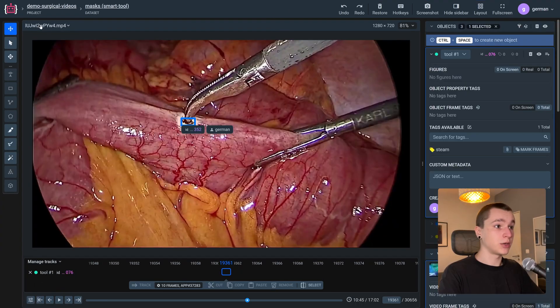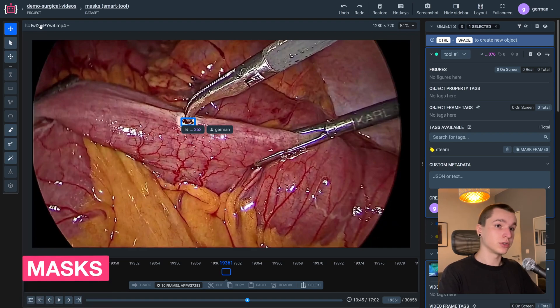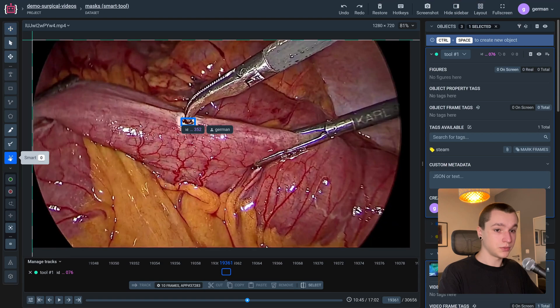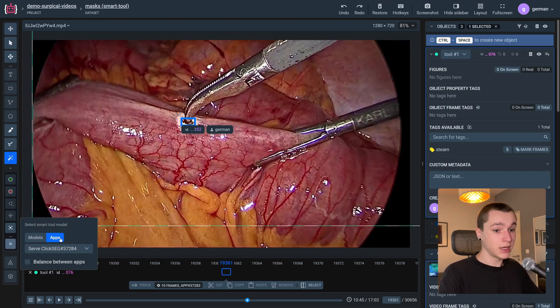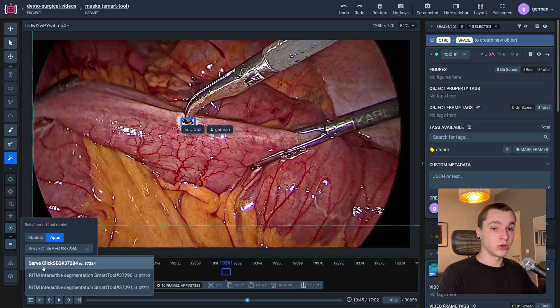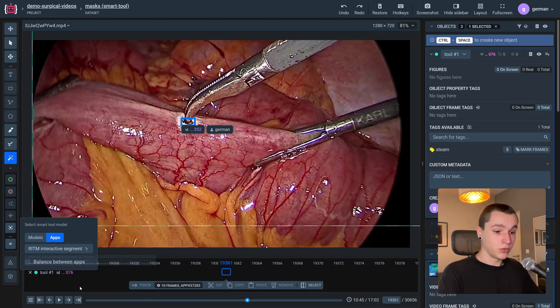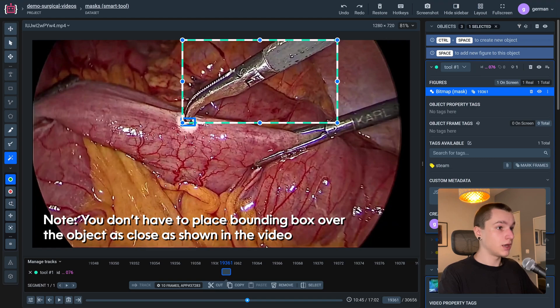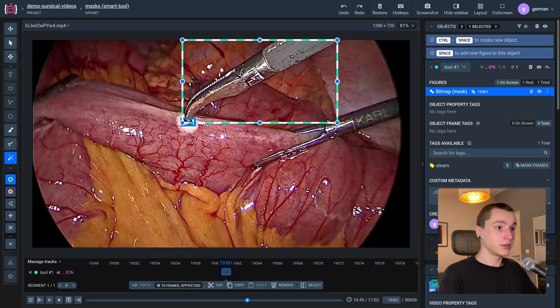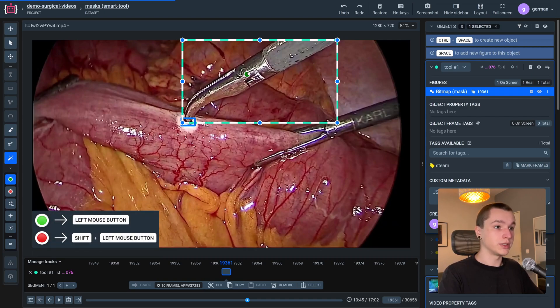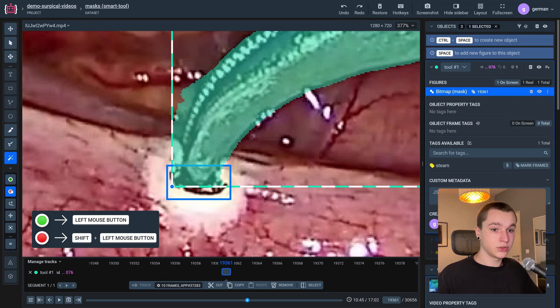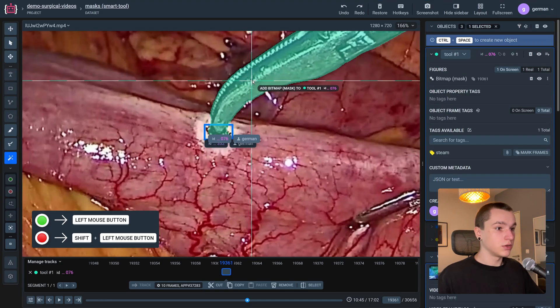Now to the masks. The last annotation type I'm going to showcase today is masks, also known as bitmaps. The algorithm of tracking objects on videos with bitmaps is quite different. First we need to grab the Smart Tool, then go to the AI tab and select the deployed interactive segmentation model. I'll go with Ritm. Then we need to place our object into a bounding box and place positive and negative points. We place a positive point on the object, and if we see artifacts, we place a negative point so the model can predict better.